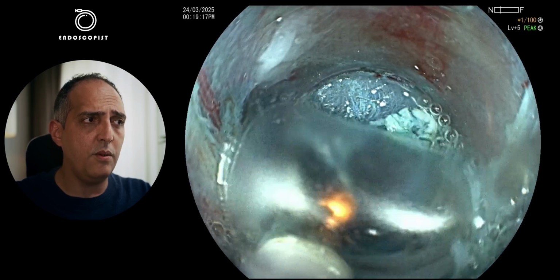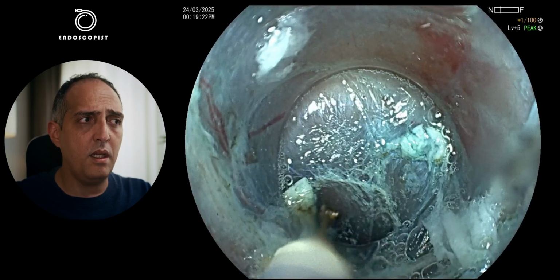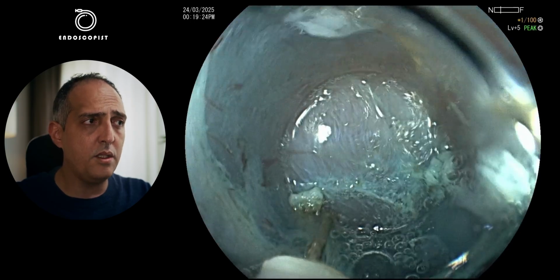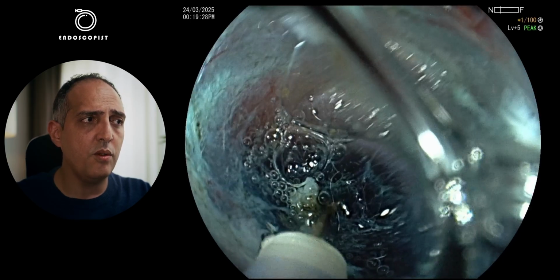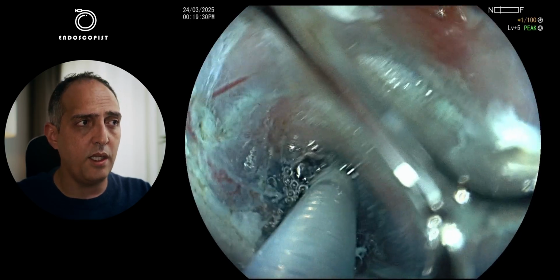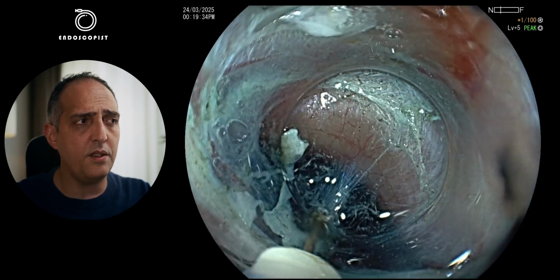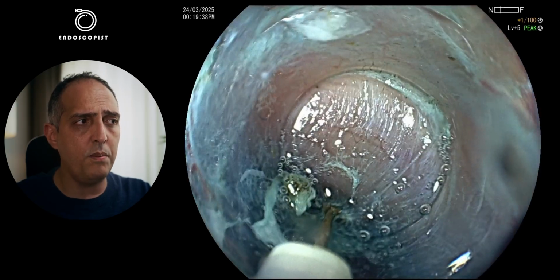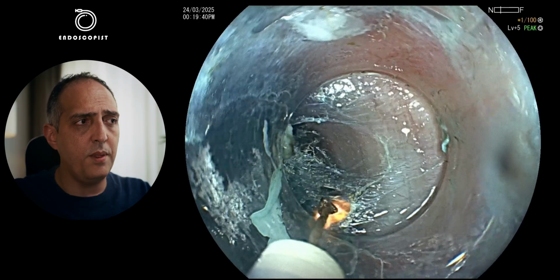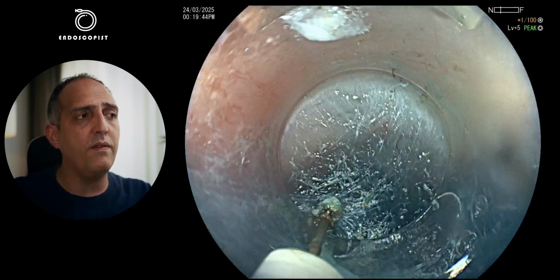As you can see here, we are already entering the tunnel in less than a minute. So only the edges, and with very minimal spray coagulation, we do the dissection. Again, I inject with the knife. This is a triangular knife from Olympus, which I love when I do a POEM because its triangular tip has a very nice spray coagulation effect.